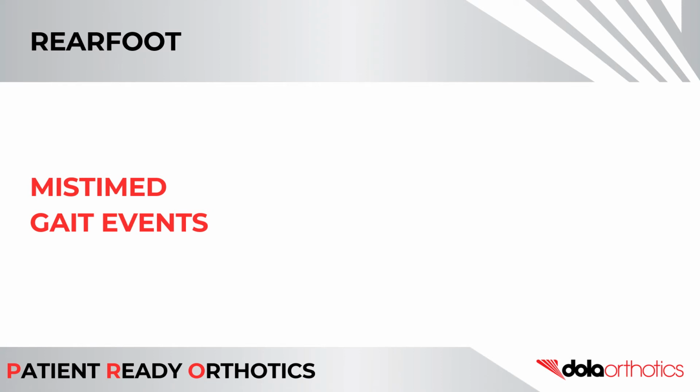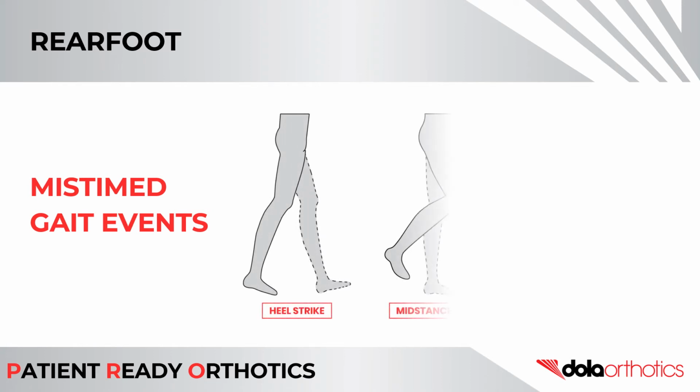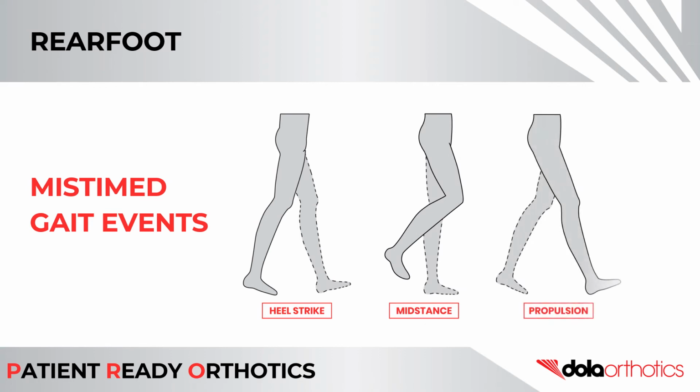Mistimed gait events may also contribute to pathomechanics, including heel strike, prolonged mid-stance pronation, lack of resupination, early heel lift, midfoot brake, low gear toe-off, and impaired propulsion and windlass mechanism.